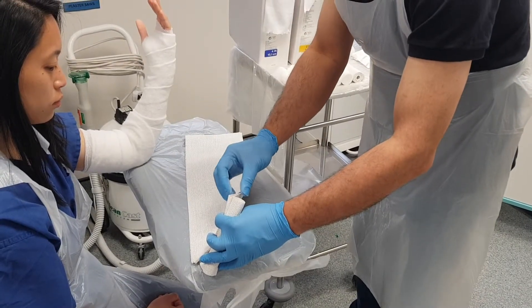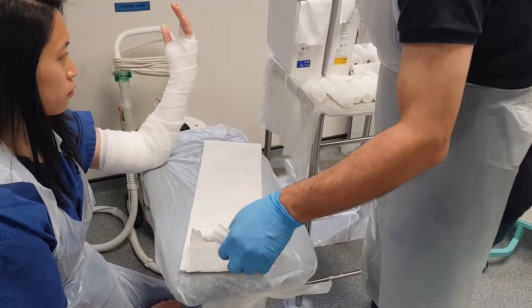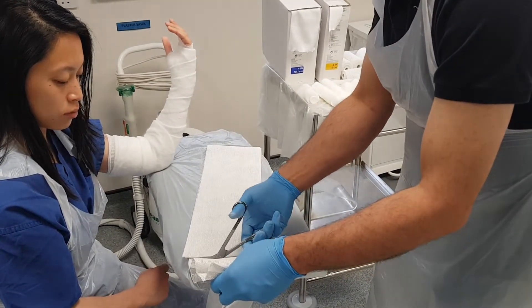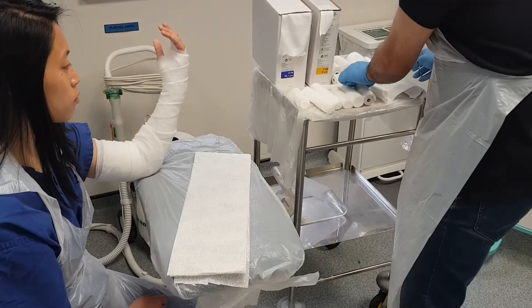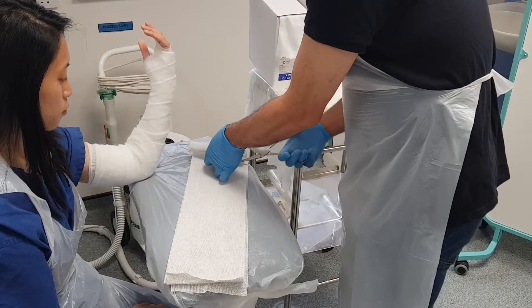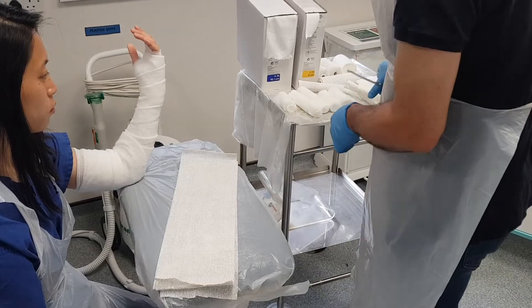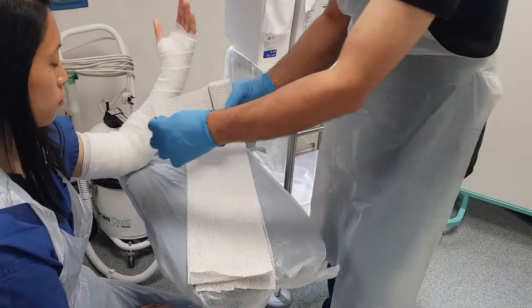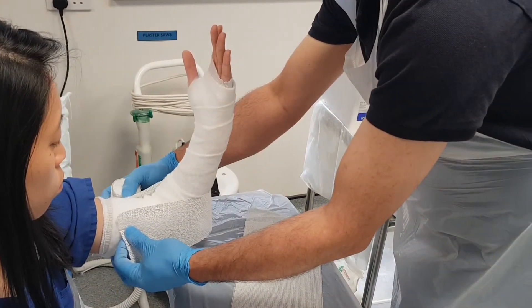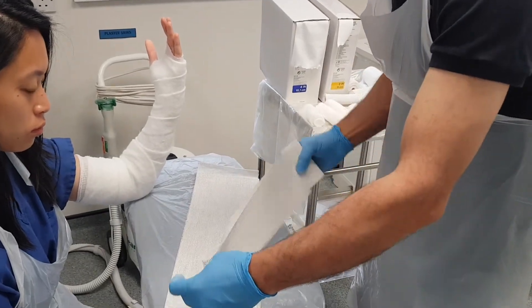I'm counting out the layers — one, two, three, four, five — I'll get six layers. We're going to do this round of the slab, and then use another roll as well. This again is going to be six layers thick.